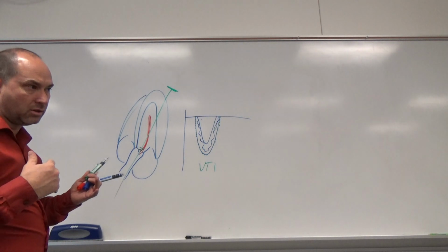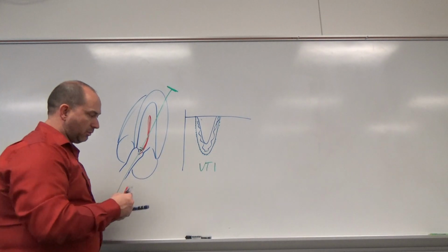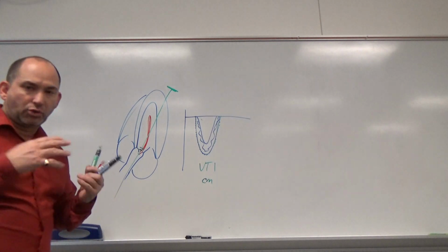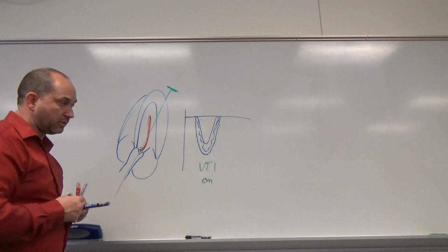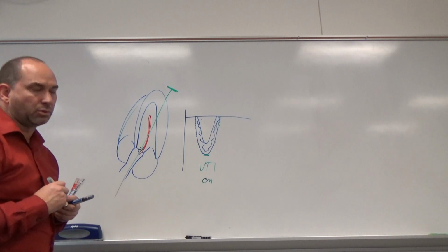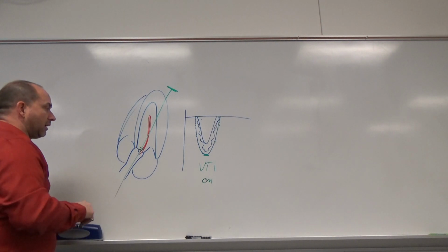It shows us basically the mean velocities that are going on as a whole. It's measured in centimeters as the units. And we're going to trace that, and that's going to give us some insight into the flow of the aorta, or what's about to go out of the aorta. And with doing that tracing, it also gives us a peak velocity. So that's the PW, that's what we measure on it. That's every time we do an echo.